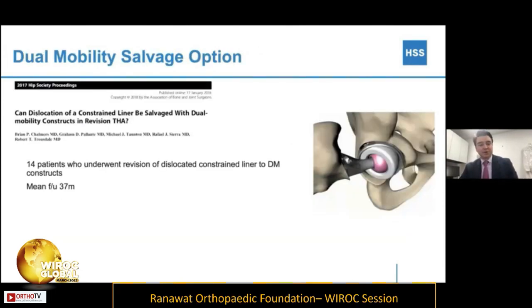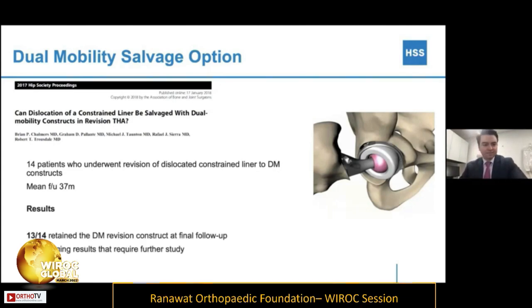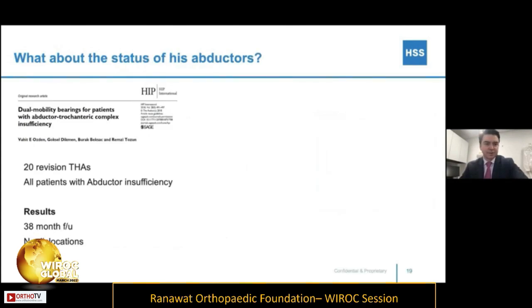Brian Chalmers, who gave a talk to you earlier today, wrote this paper when he was a resident at Mayo Clinic, looking at a small cohort, so there's opportunity for further research, of patients who failed the constrained liner and were converted to a dual mobility as a salvage option because they'd already failed the constrained. Throughout 3-year follow-up, the results in this small cohort were encouraging: 13 out of 14 had basically retained their construct and had not redislocated at final follow-up. But obviously, we need larger numbers to look at this further.